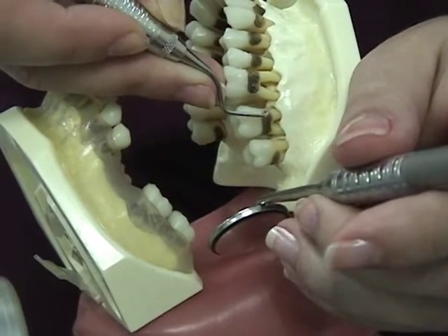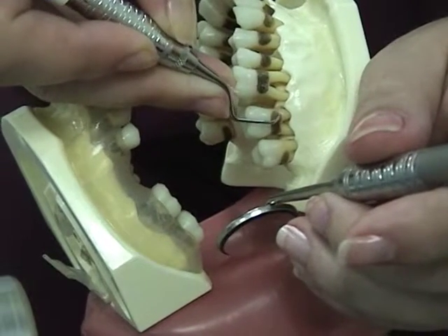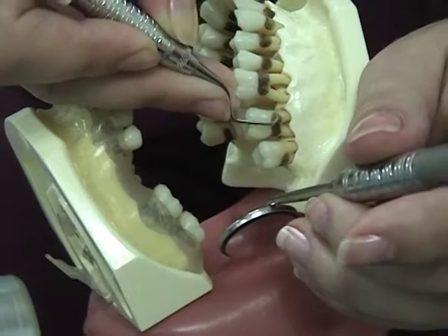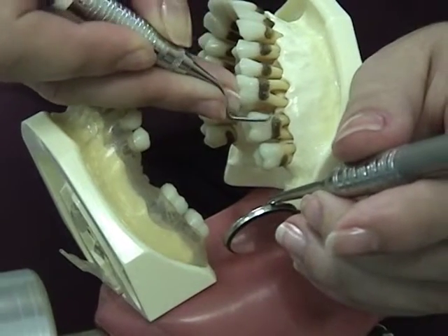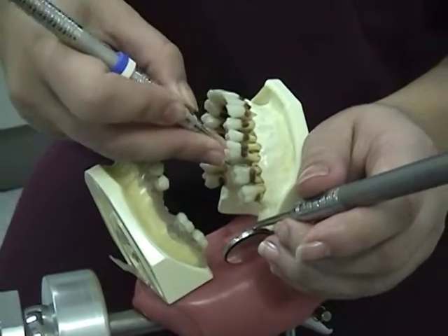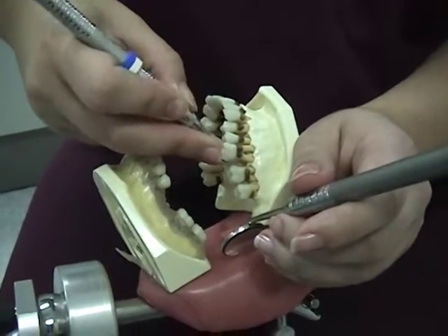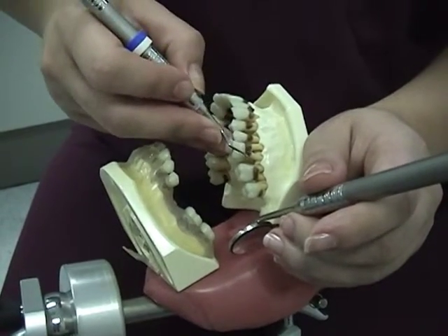For the stroke, press against the tooth with the fulcrum finger and activate a pull stroke away from the junctional epithelium. Use a wrist rock for strength and control, pivot on the fulcrum finger, and roll the handle between your fingers as you go around the tooth surfaces.